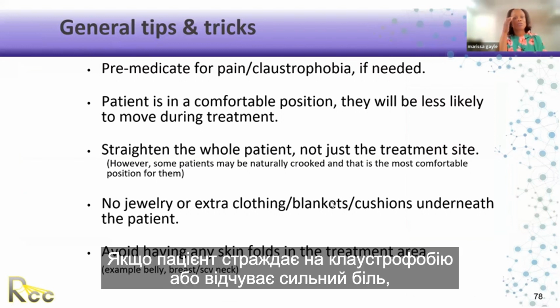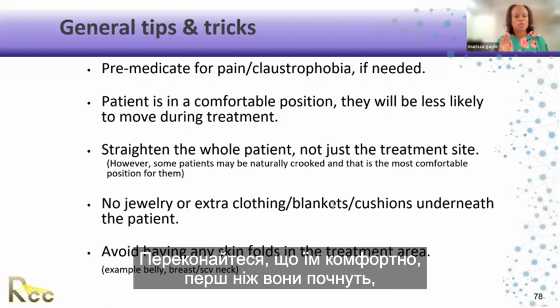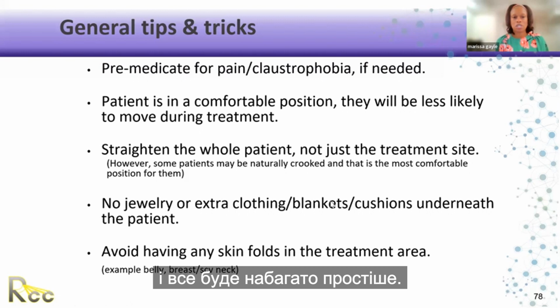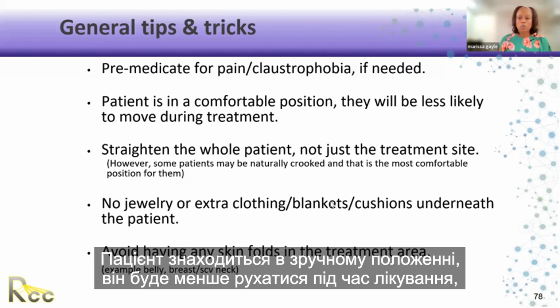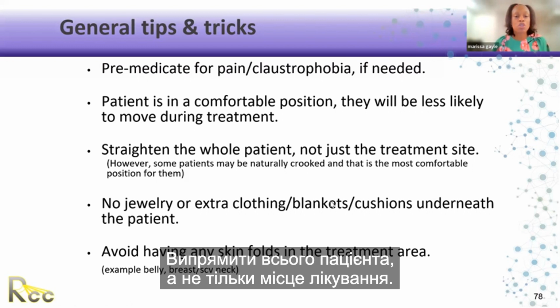If patients are claustrophobic or in a lot of pain, pre-medicate. Make sure that they're comfortable before you start, and it makes everything so much easier. If the patient is in a comfortable position, they'll be less likely to move during treatment, and treatment will be a lot faster and more reproducible. Straighten the whole patient, not just the treatment site.